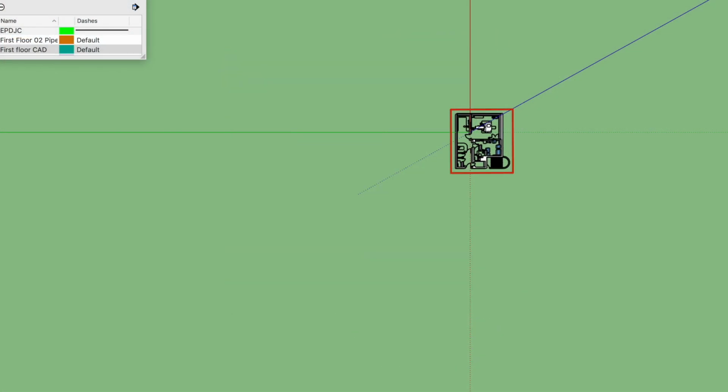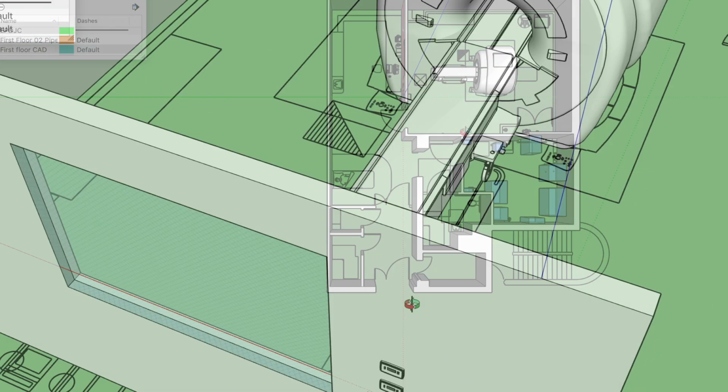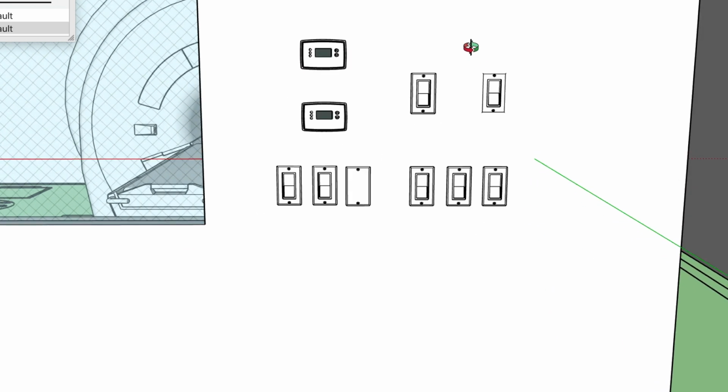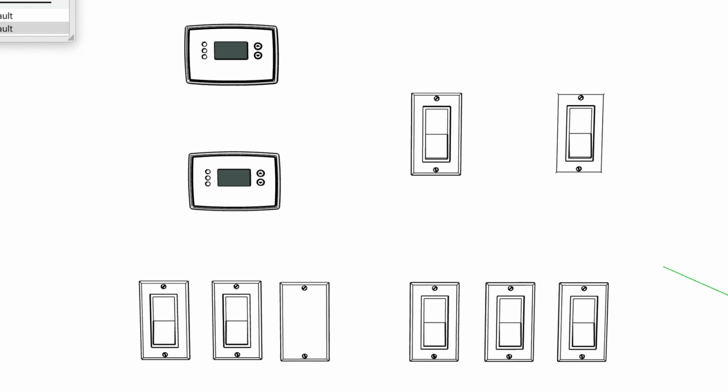And this is your MRI. Every MRI is specific, detailed, and custom. Today we're going to go over the custom features of your MRI here at Hilo Medical Center.